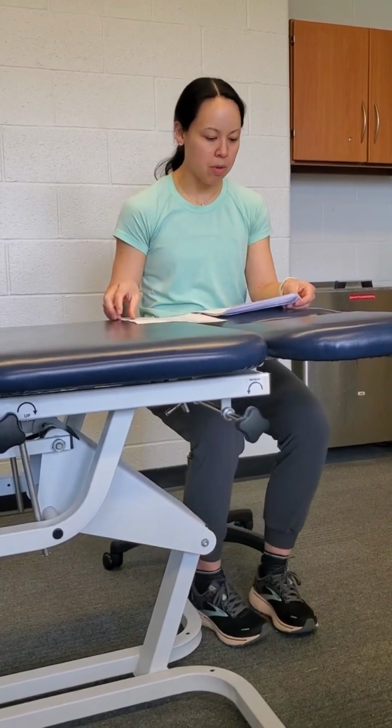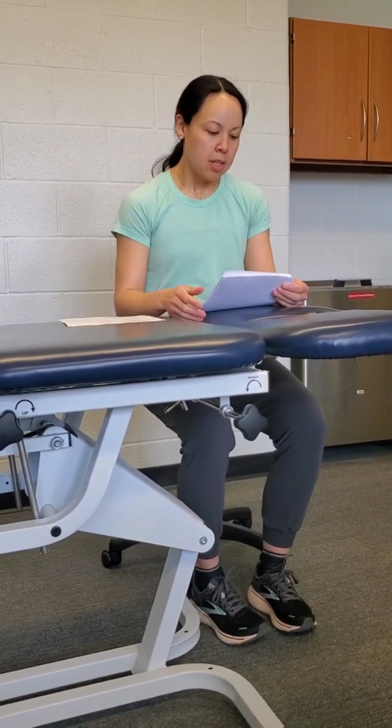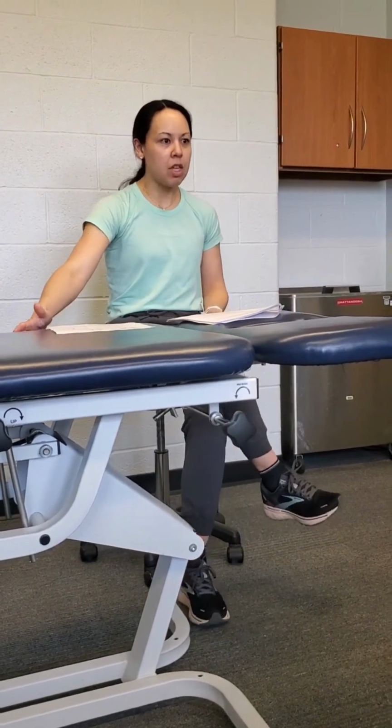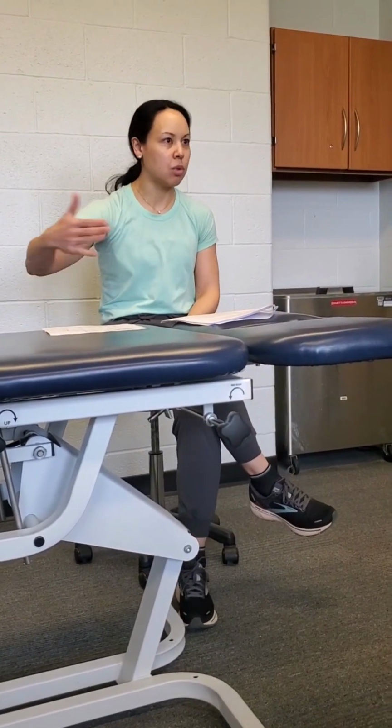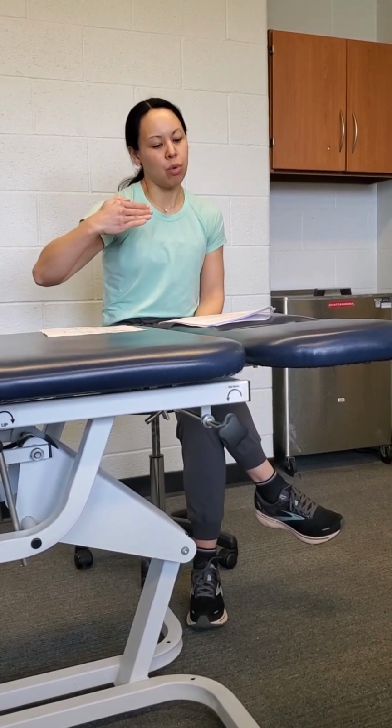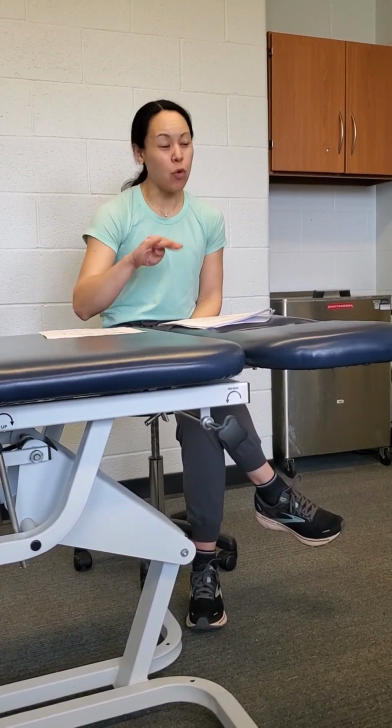Okay, so we'll just talk about the protocol. Typically the BFR protocol is 30, 15, 15, 15, meaning the first set is 30 reps and then subsequent sets are 15 repetitions. The goal is really to go through those 4 sets, and the 4th set is either 15 reps or to fatigue. So if they hit fatigue at the 10th rep, or at the 5th rep, they're done that set. And that's kind of what you want to do.